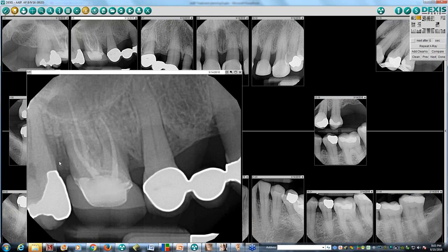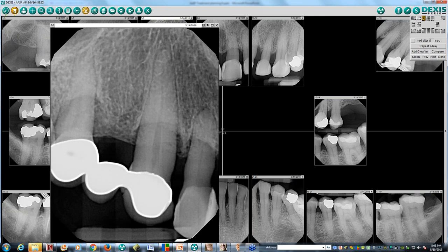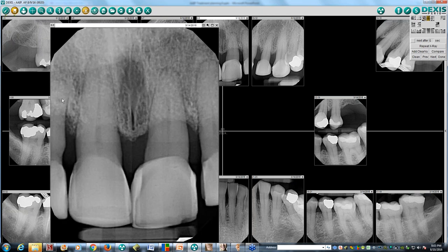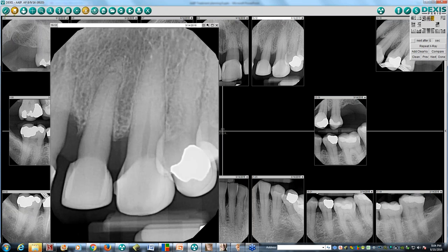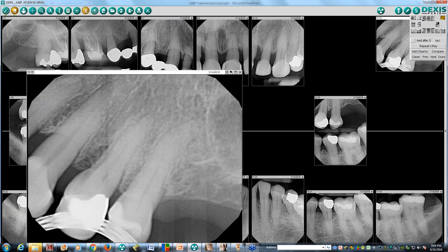This is going to be of some concern. There's concern with the endo as well. We can see the bone loss present throughout, and we can look at it two ways. We're talking about treatment planning and whether these teeth have good longevity at the age of 65. Tooth number seven barely has any support, number eight does, number nine has less. She's a class two case with a very deep overbite. Certainly we can see the angular defects present.